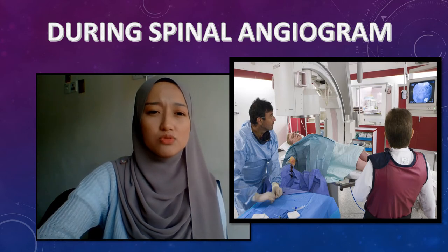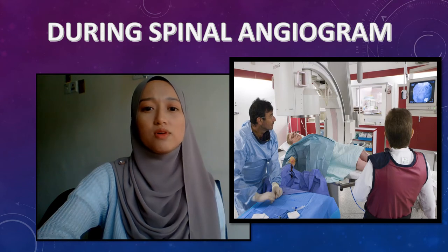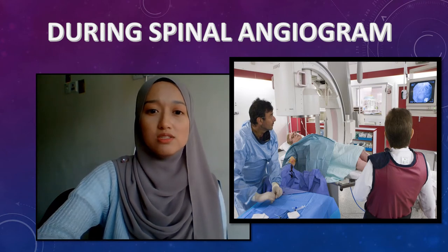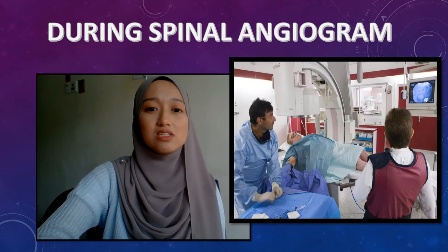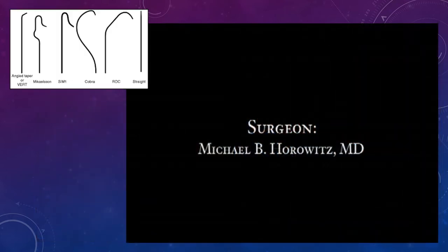You won't be able to go home immediately following the spine angiogram, as you will need to lie flat for a few hours of observation. Make sure to tell your medical team if you notice any pain, bleeding, or swelling at the catheter site before you go home. Okay, let's see a video of spinal angiography performed by Dr.